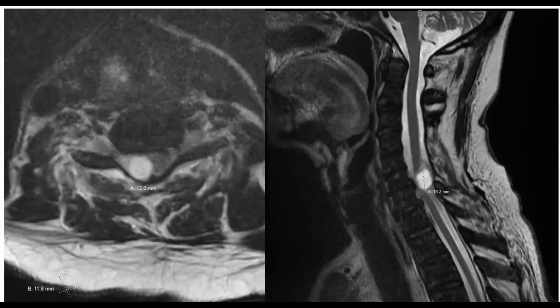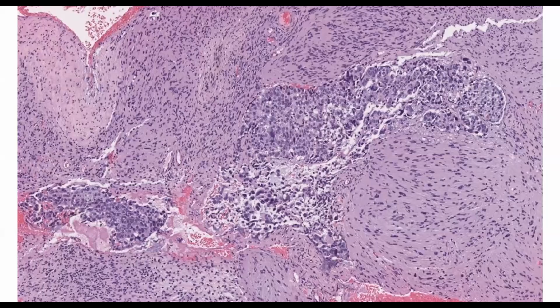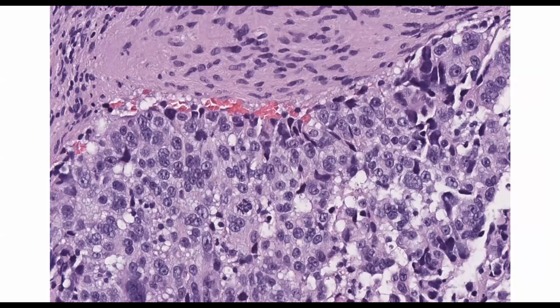All right, you have cystic meningioma, cystic everything. Okay, guess what? There's only one case. This is the case. We're not done. I still have 8 minutes. 3:52. What is this? It was only present in one tiny microscopic focus, not macroscopically visible. Here's a little bit higher power. That's the craziest looking schwannoma I've ever seen. So I guess it's a malignant schwannoma.